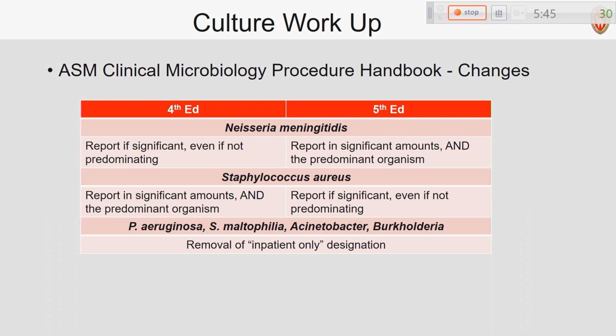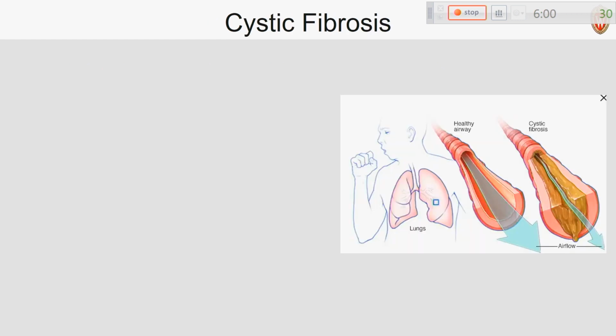And Pseudomonas, Stenotrophomonas, Acinetobacter, and Burkholderia. There used to be a designation in the handbook for reporting those only on inpatients. That designation has been removed, so we'd be looking for those on all patients.